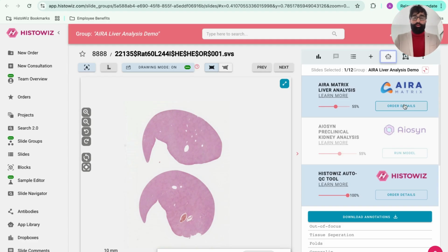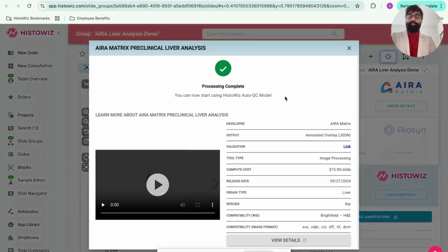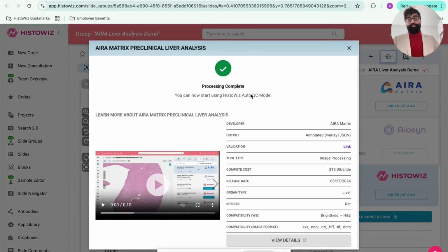But once you click on Run Model, and say I click on Order Details for now, you can see that the processing has been completed. And if it was not completed, it will give you an option to look at this page. So here you can quickly look at what the AI tool is doing, like a quick mock-up demo, with a few links to validation reports and the compatibility and things like that.